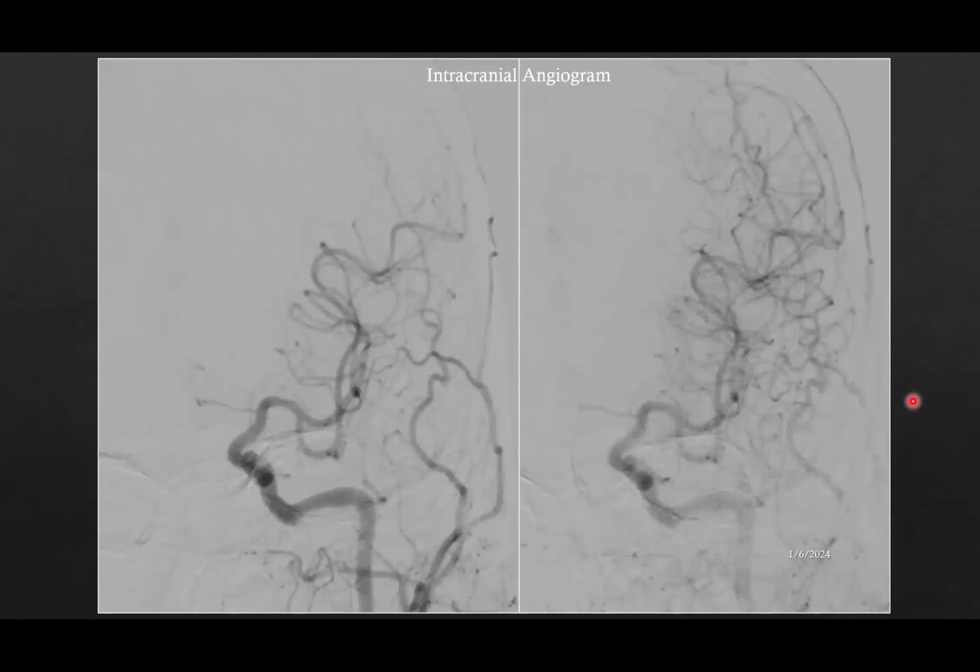This is an intracranial angiogram prior to the stenting. You can see that there's a shift in the watershed, which is shifted more towards the lateral aspect. The ACA is not visualized, very faintly visualized. This is the angiogram showing a tight stenosis, measuring more than or close to 90%.